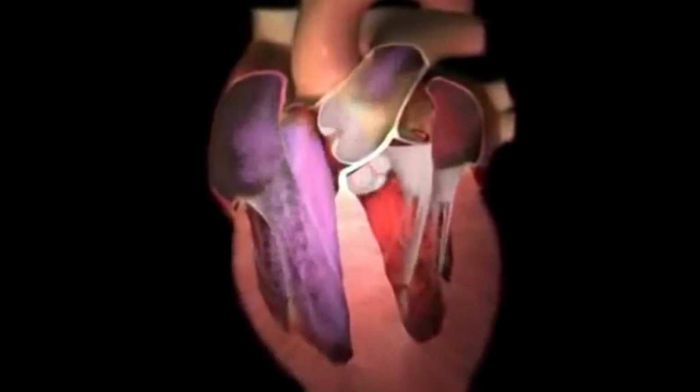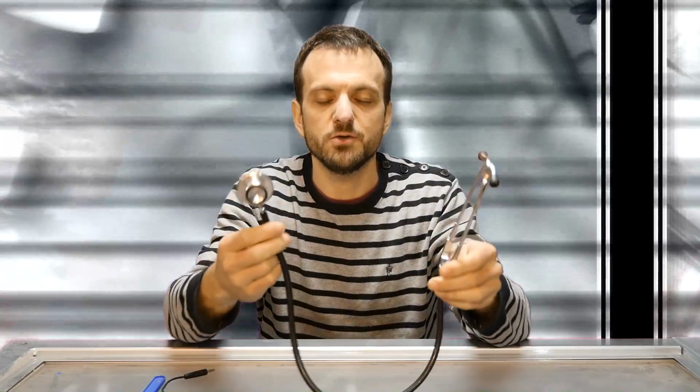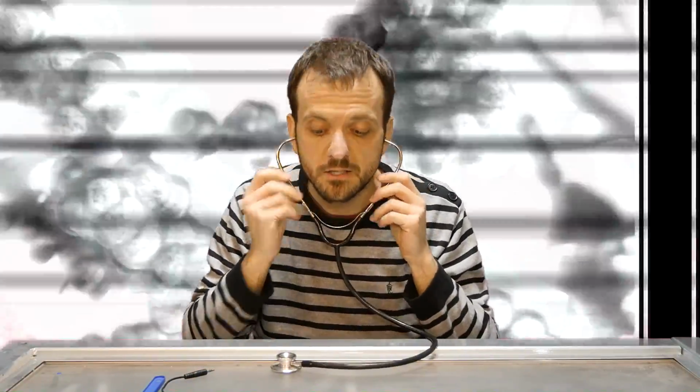It has valves, chambers, bits and bobs. And I'll put a diagram up on the screen and you can have a look. Look at all those intricate workings. So doctors traditionally use a stethoscope, and they pop it on their ears and listen around to see if they can hear what the valves and the chambers are doing. The chambers are squeezing and the valves are opening up like little doors, and they're mechanical devices, really. So you can actually hear them opening. And if there's a problem, they'll hear that tick tock, time is ticking, gonna expire soon.